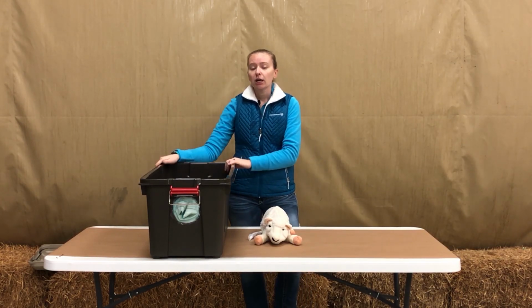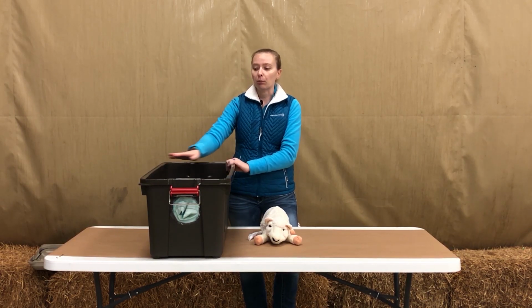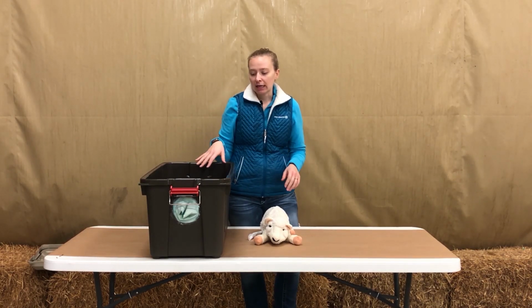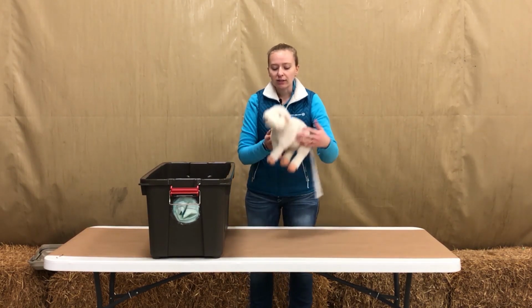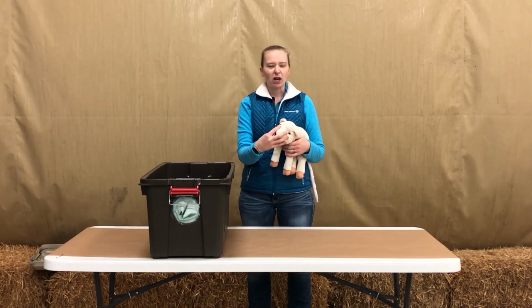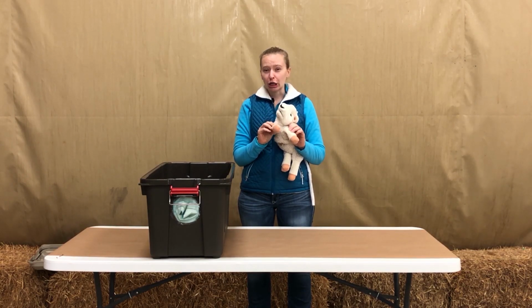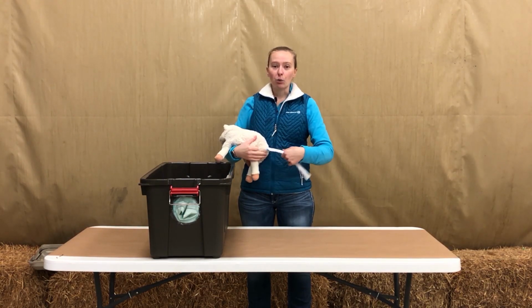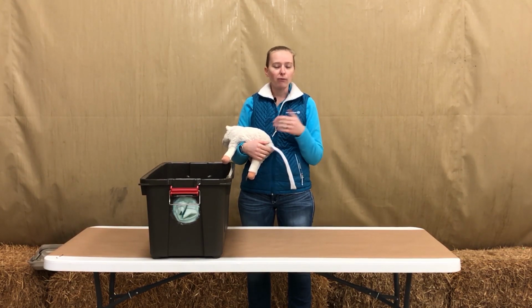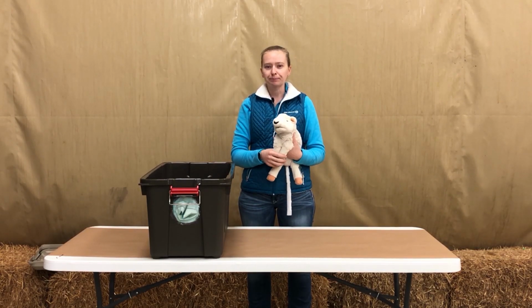So today with us we have some simulators of an actual ewe, which is this rubber plastic tote that we have, and then we have a birthing canal or birthing system in there. We have some little animal replicas that are baby lambs. They've got a fairly solid face and some hard structures in their legs to feel like bones, and a wonderful little tail that has been sewn on that does feel like there's little vertebrae in there. So hopefully when we practice we can actually tell what each of those parts are.